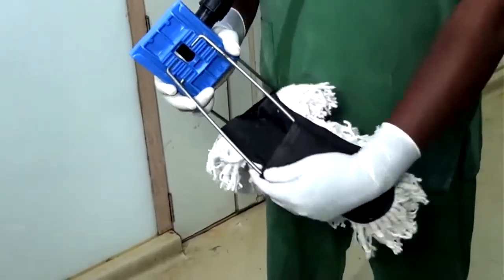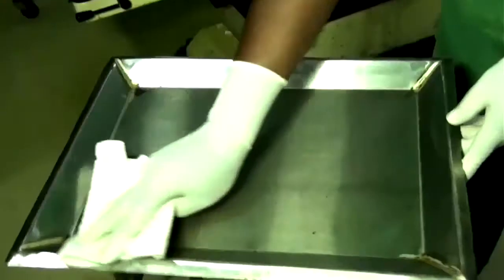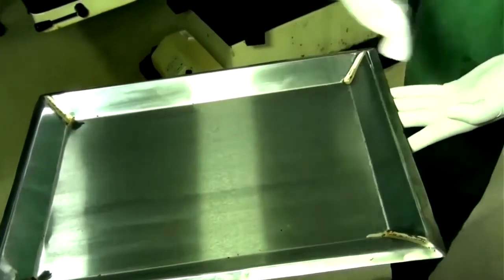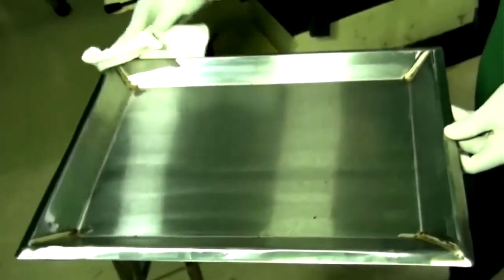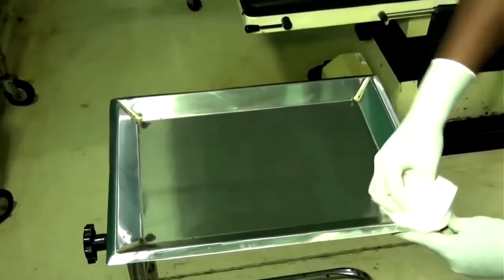And always the mop should be removable so that you can wash, dry, and even autoclave if you want before you repeatedly use it. Trays can be wiped clean, the same unidirectional method. Cover the edges also. This is the figure of eight of cleaning the surfaces.